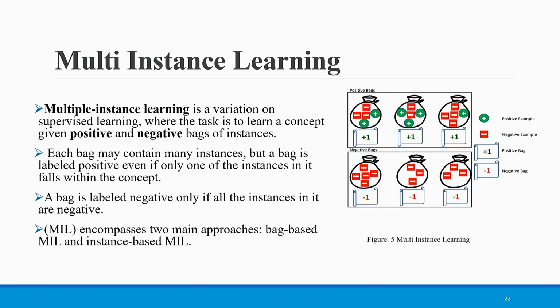No, training sizes are a different thing. It's not actually related to the model training. First, we take images at different magnifications and see which magnification level we are using for training. For our model, we used 5x magnification. So magnification is just the level, just the size. If you take 5x, 10x, 20x or 40x, it's just size. You will get more in-depth detail about the tumor and the tumor-relevant part in the image.